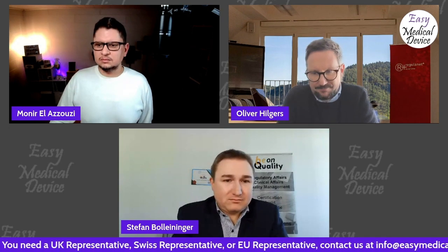Yeah. No, but for example, take the ProCam test, the prediction of a heart infarction within the next 10 years. Even if a doctor would use it, I wouldn't see that it relates to Rule 11 in terms of taking a diagnostic or therapeutic decision, because it's 10 years away. So even if the doctor is using it, it doesn't make sense to me to have this as a class 2A. I rather think the approach from the MDR is that these kinds of simple approaches are not even a medical device. That would be my preference.